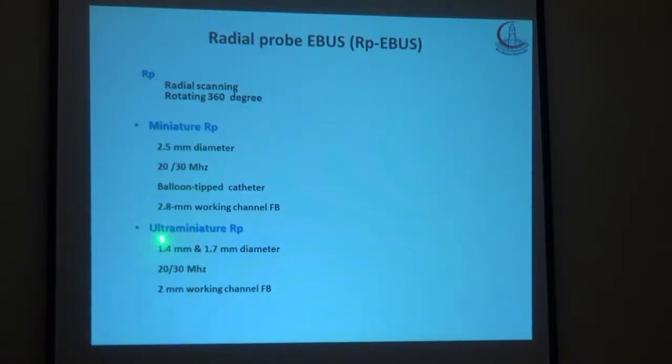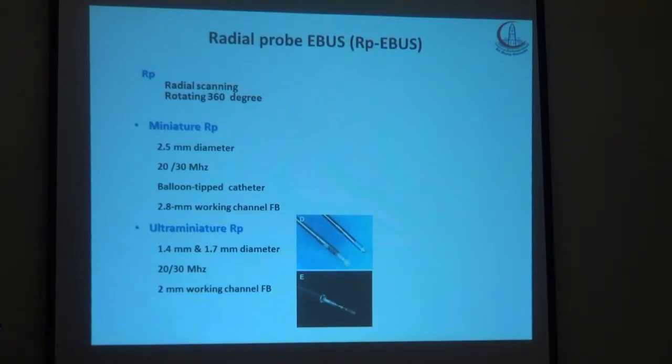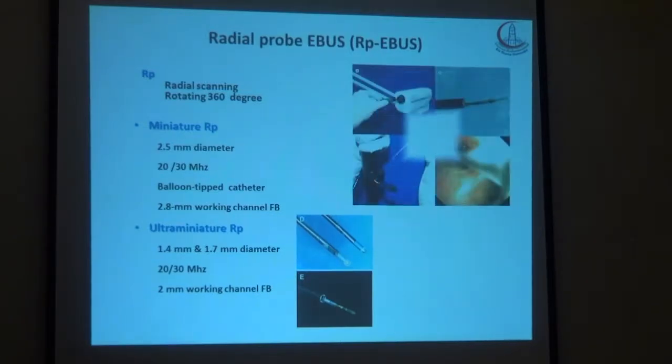زي ما انتم شايفين السايز بتاعها 1.4 أو 1.7، حجمها صغير جدا، ما بتحتاجش بالونه، بتركبها على طول وتدخلها من الـ 20 و30، البوبيلر منها 20، بتدخلها في منظار صغير الوركينج شانل بتاعته 2 ملم، وده كويس لأن انت عاوز توصل البريفري بتاعت اللانج. اللي قبل كده الثانيه دي المنظار كان بيبقى 2.8، فما بتقدرش توصل للبريفري وانت أصلا داخل عشان تدور على بريفرال لانج ليجنز، فلازم تخش بمنظار صغير عشان تقدر توصل مور بريفرال بالبروب بتاع السونار.